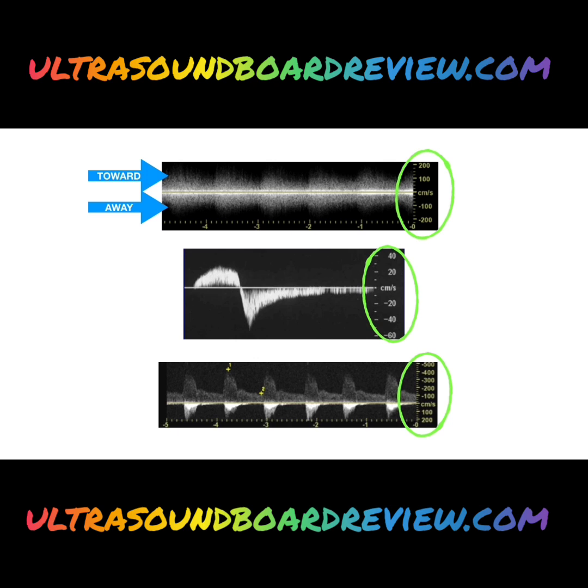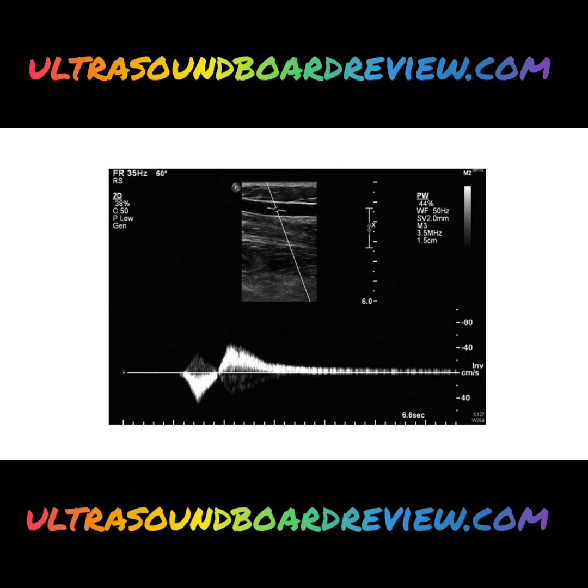Same thing here. Positive numbers are on top this time. That flow's going towards. Negative numbers on the bottom. That flow's going away. And now we have the negative numbers on the top. It doesn't matter, top or bottom. Negative is away, and positive is towards.